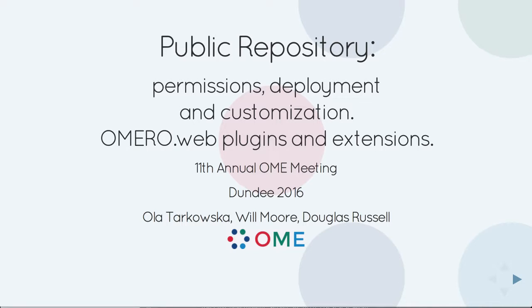Hello, my name is Tarkowska. I'm a software developer in the OMERO team based in Dundee. Today I would like to talk about the OMERO public repository and the web interface.